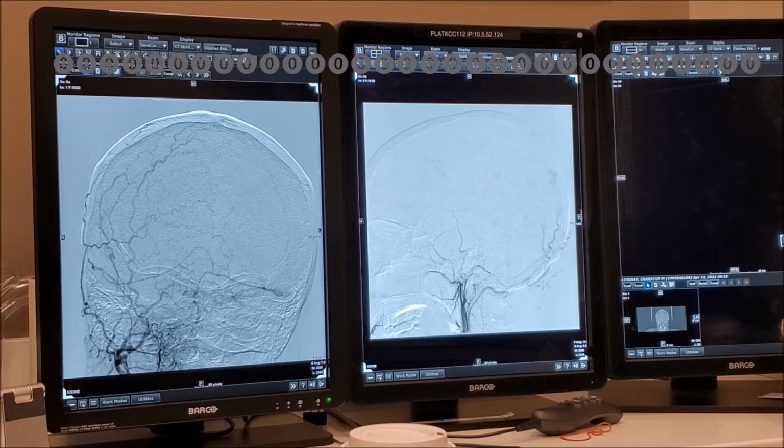That's the occipital. And what happened in this angiogram? What happened to the occipital? Oh, it was only partially selected. Correct. So that means your catheter is, there's something else that is very well opacified, right? Uh-huh. What is this one? Ascending pharyngeal. Now let's get a little more sophisticated.